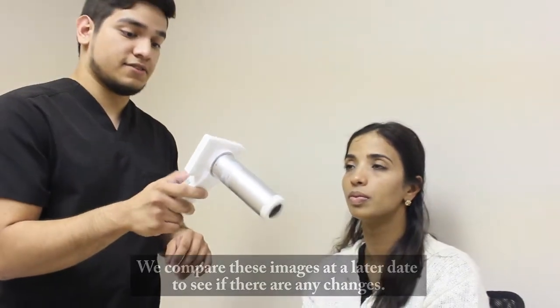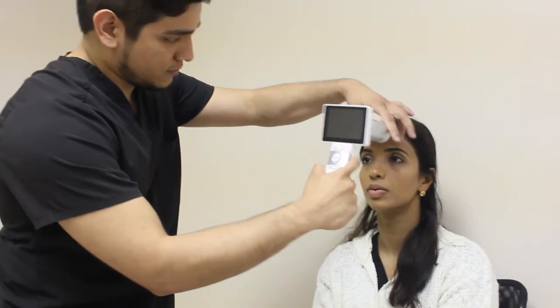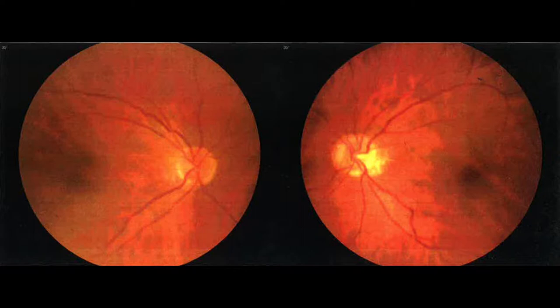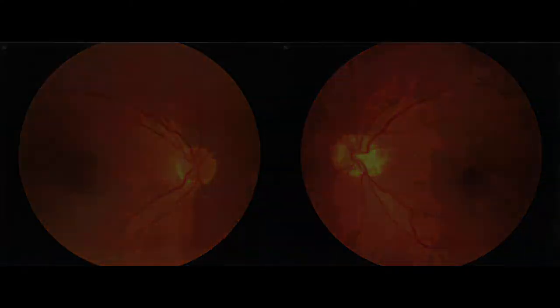And then I'll do your left eye next, so I'm going to make that clear. All done. We'll just get this ready for the doctor and we'll get you to see him next.